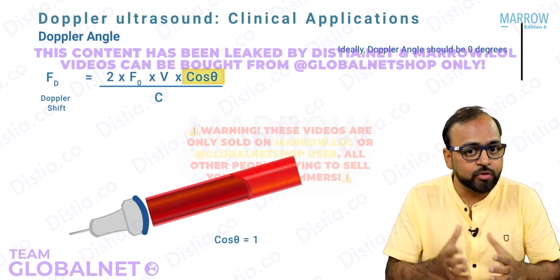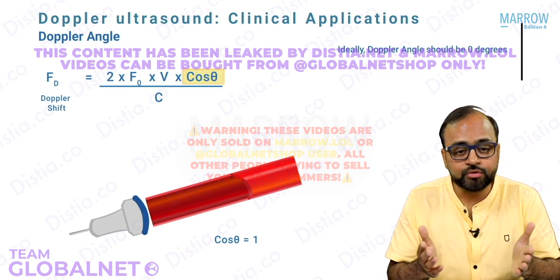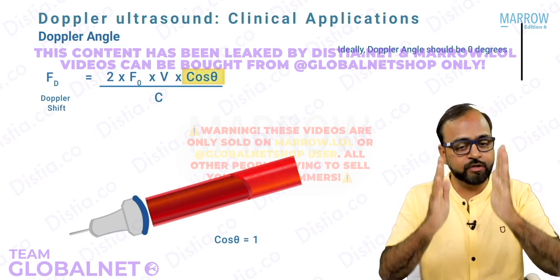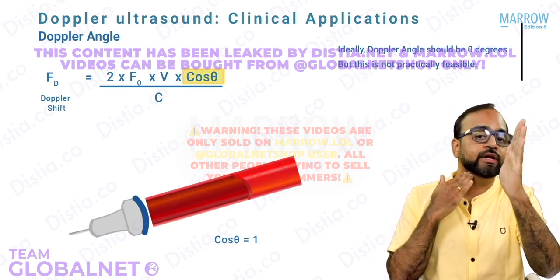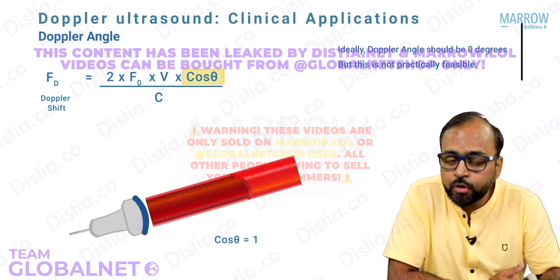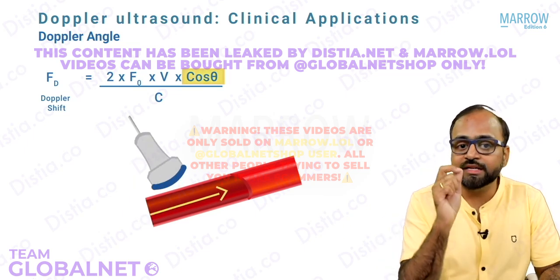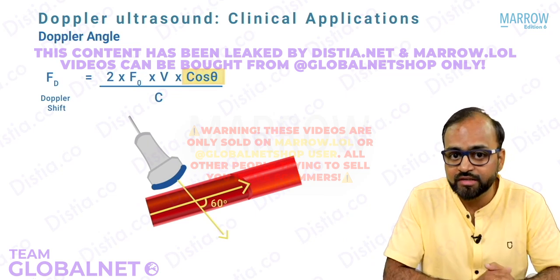But is it practically possible for us to angulate the ultrasound beam along the blood flow? It is not. Look at the carotid arteries. The carotid arteries are traveling vertically. The blood is traveling vertically. Can I angulate the probe vertically like this? It is very difficult. Therefore, this is not practically possible. What is practically possible almost every time is that the probe can be angulated slightly such that the value is kept somewhere close to 60 degrees.